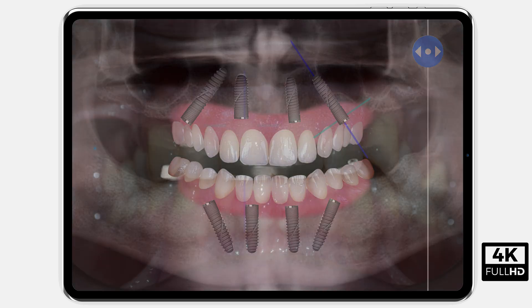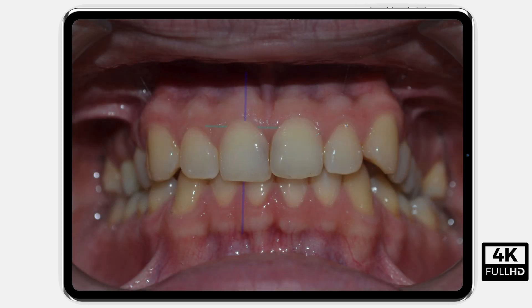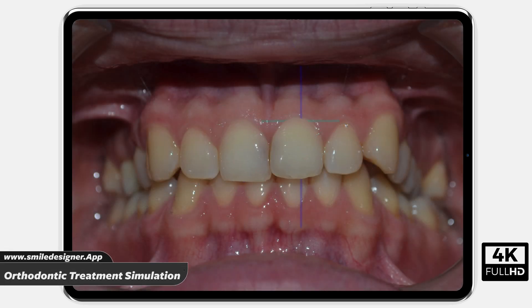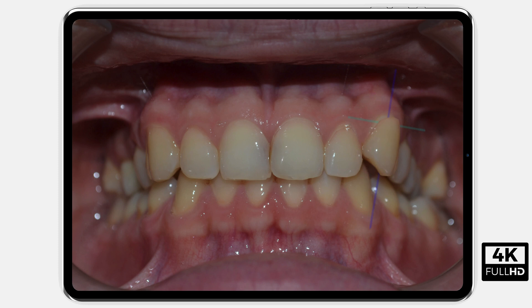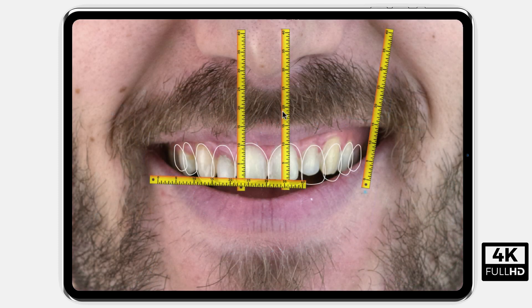Orthodontic treatment simulation can be performed. The software can produce image outputs integrated with all CAD-CAM systems for the designed smile.